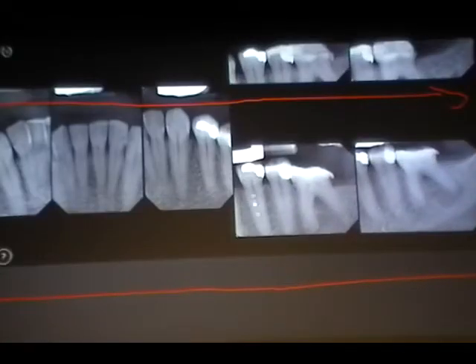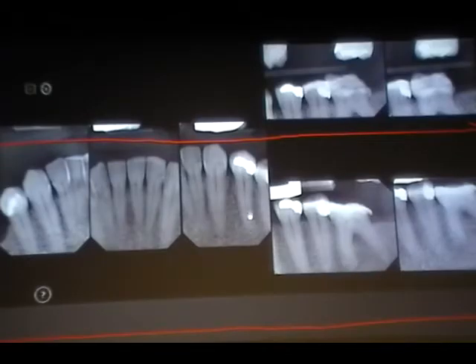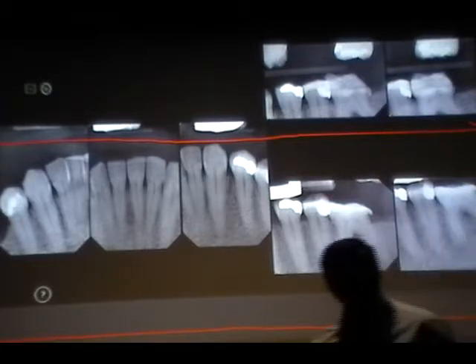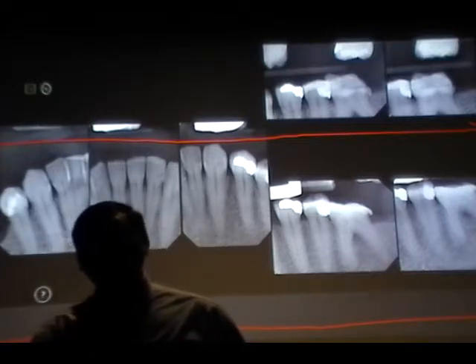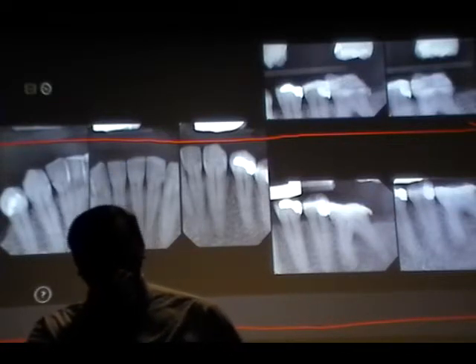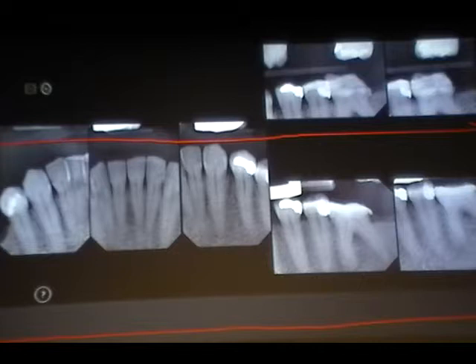How about this one? Missing apex and open contact. How about this one? We'll go to there. Yeah, Angelo, next to you. Yeah, it looks pretty good. The open contact. Your name, please. Dave. Okay. You can see the crown, you can see the apex, you can see the open contact. Okay. How about the next one?